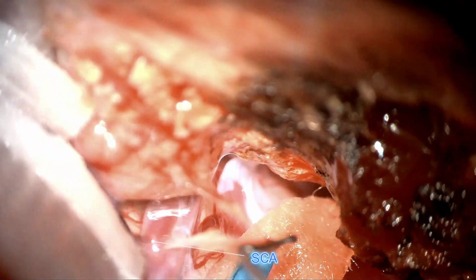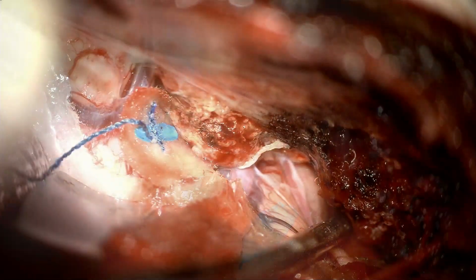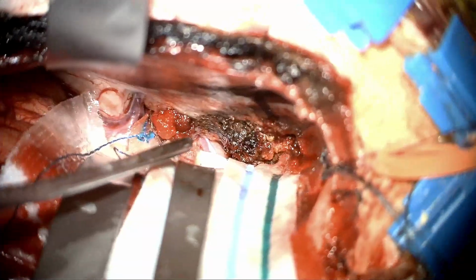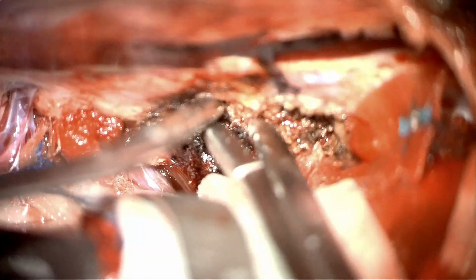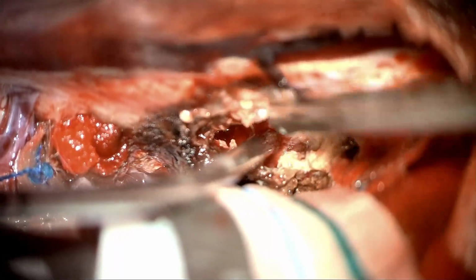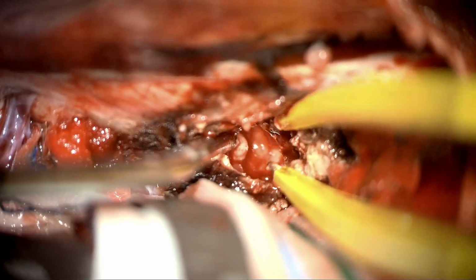See how I'm pushing the cerebellum down with my suction as I identify both superior cerebellar arteries. Now we have freed the tumor from the arachnoid attachment inferiorly, and it is protected here with a patty. Now we're going to proceed with some debulking of the tumor to facilitate its rotation from the contralateral side. Here you can use either the Sonopet or the side-cutter suction device. The tumor is very vascularized, so we need to combine devascularization with bipolar and tumor debulking.